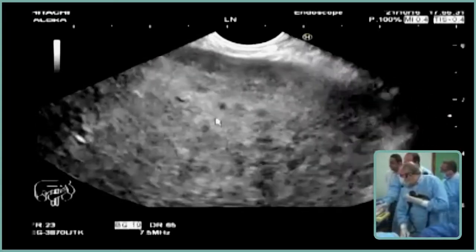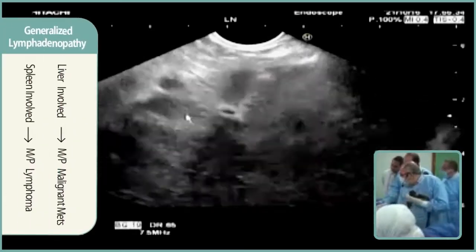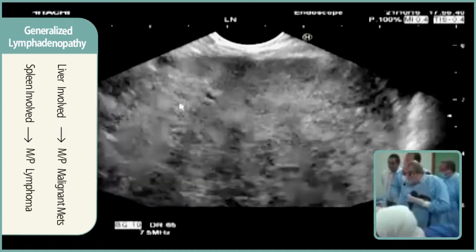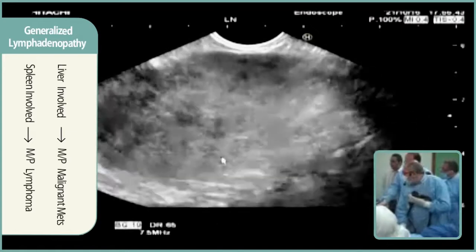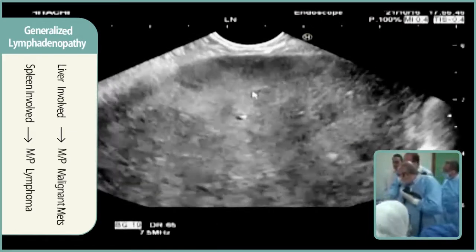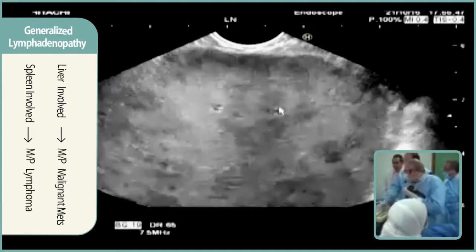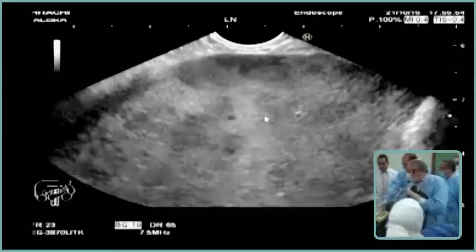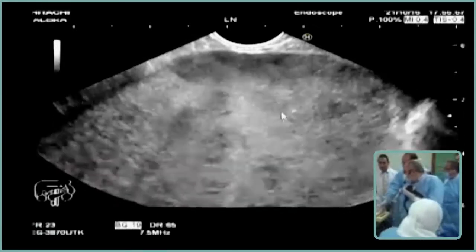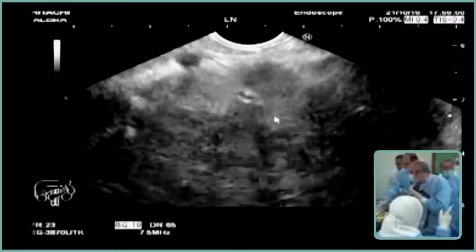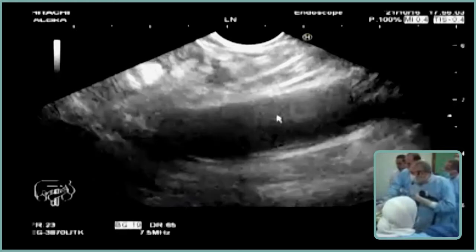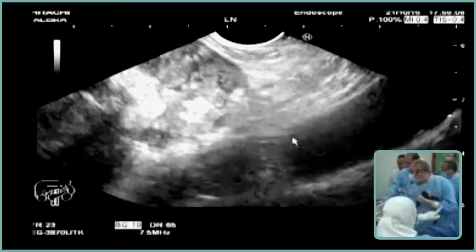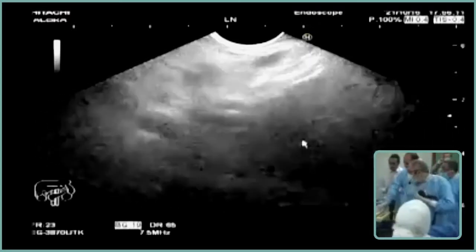This is the spleen — this is classic lymphoma. Innumerable multiple focal splenic lesions, highly impressive of lymphoma. Metastasis nearly does not produce splenic metastasis — metastasis is almost always in the liver, and it is very rare to have splenic metastasis. If there are splenic focal lesions, then it is mostly lymphoma and not metastasis. So my first possibility is abdominal lymphoma.